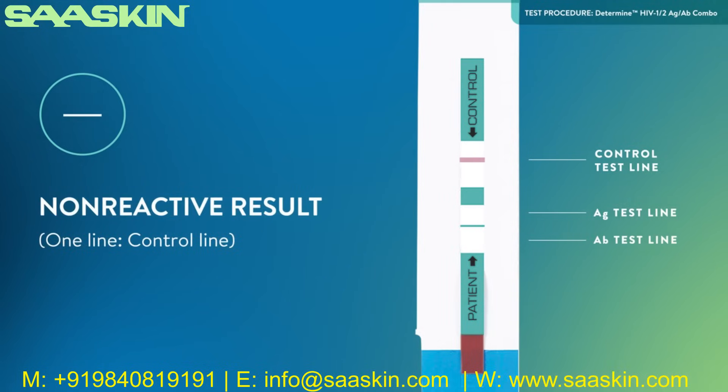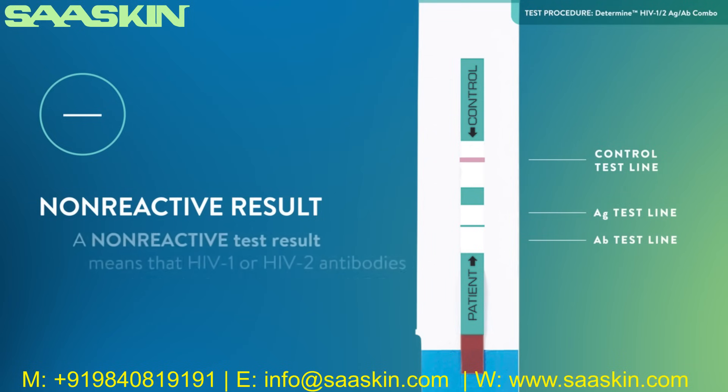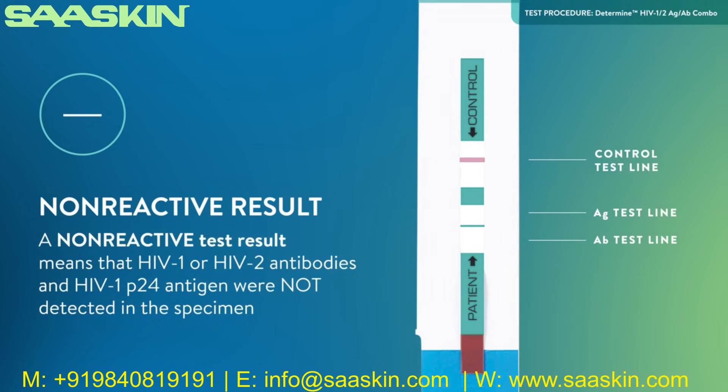Non-reactive result — one line: control line only. A pink-red control line appears in the control area of the test unit, and no pink-red antibody or antigen line appears in the lower test area or the upper test area of the test unit, respectively. A non-reactive test result means that HIV-1 or HIV-2 antibodies and HIV-1 P24 antigen were not detected in the specimen.